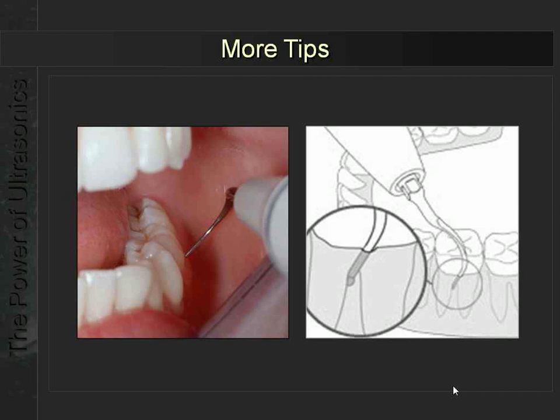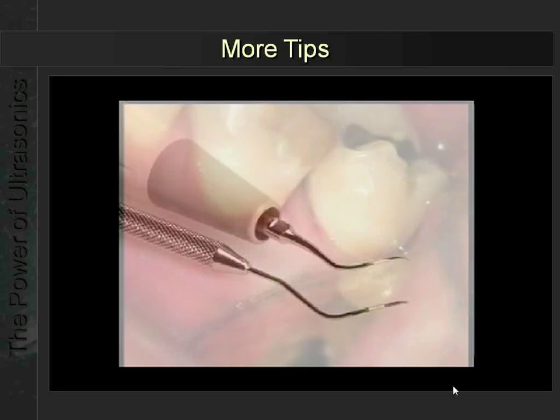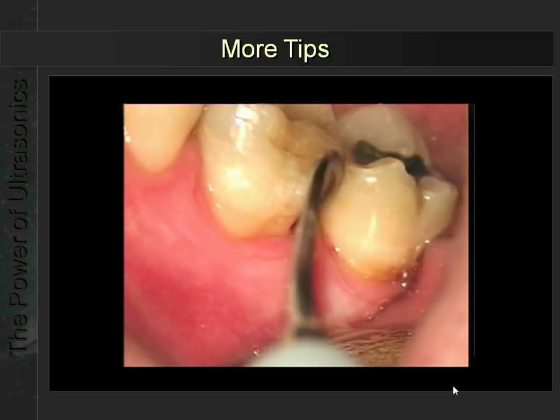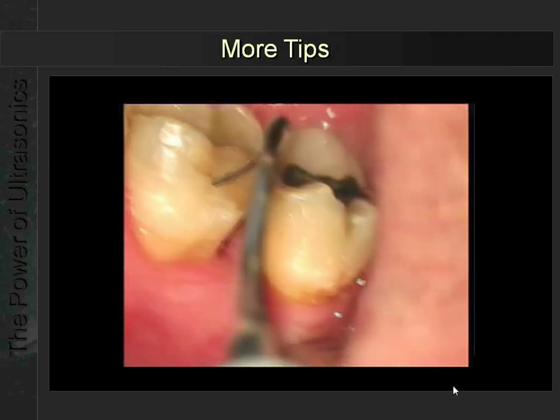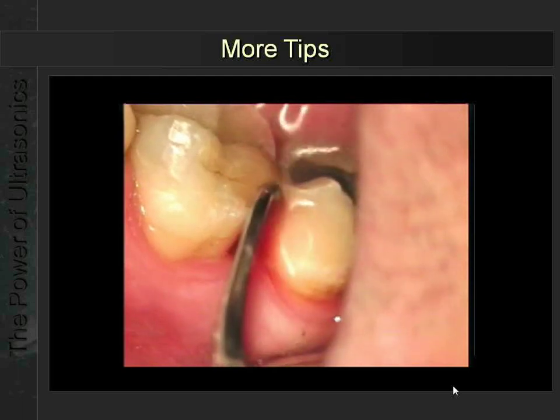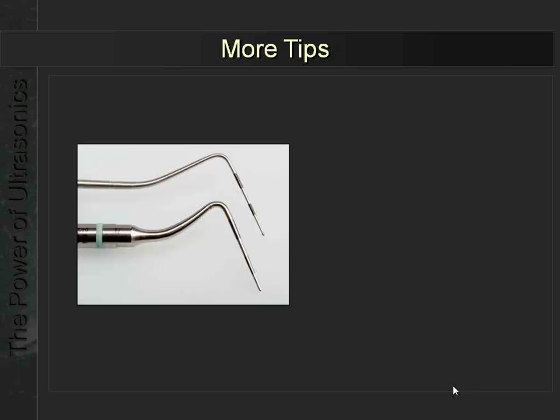And this is an explanation from the EMS company on how it should be used. And I think there is a little video which shows an example. So you see, this is almost like a furcation probe, the tip that is being used. Again, this is the first molar at the distal. You can see where we're probing first, finding the furcation entrance. Try to imagine getting into this furcation area with a hand instrument. That would almost be impossible. Just by trying to clean it like this, you can at least have some effect in this furcation area. Furcations are a periodontal nightmare, so it really reduces the prognosis of teeth.